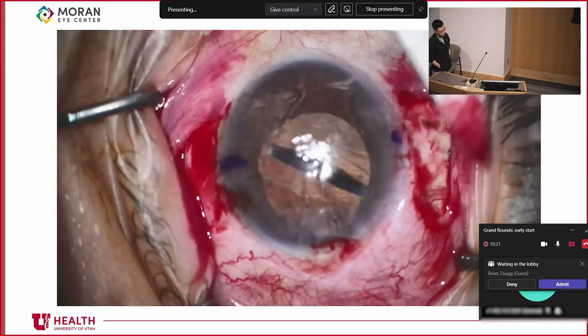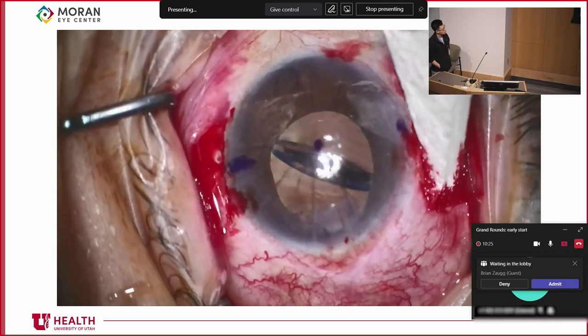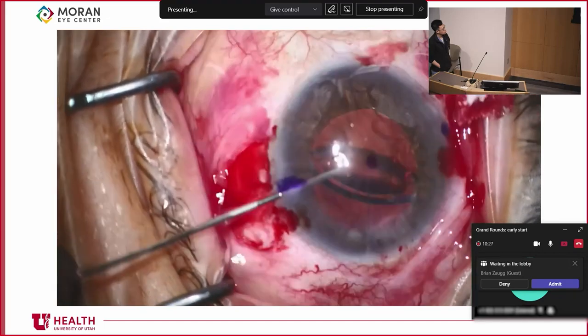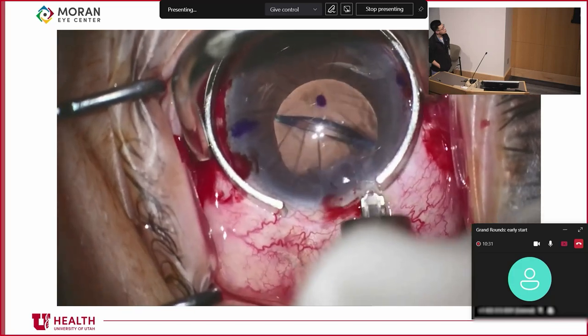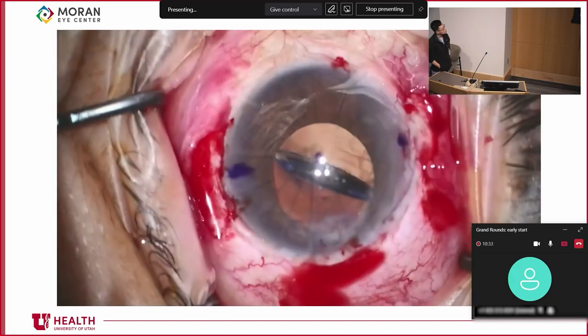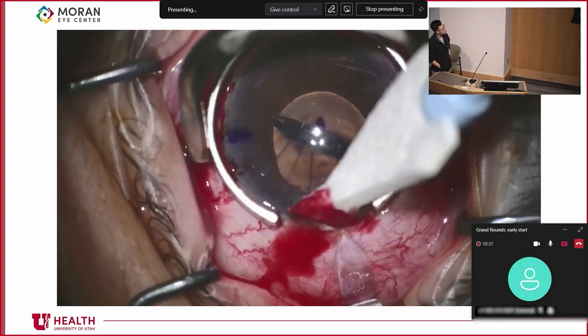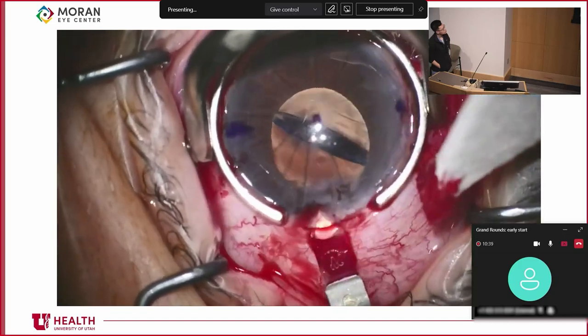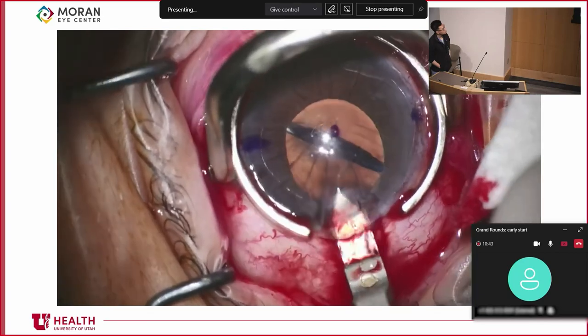All right, well, at this point, we know that the haptic bulbs are fine and they're in place where they're supposed to be. So I don't know. We've got to get this thing out. So we're going to go ahead and put some viscoelastic in here. And yeah, it's just going to the back of the eye. That's not supposed to happen. And now we're going to use the diamond step blade to make a stepped incision. That's for a large wound to be able to more easily seal.